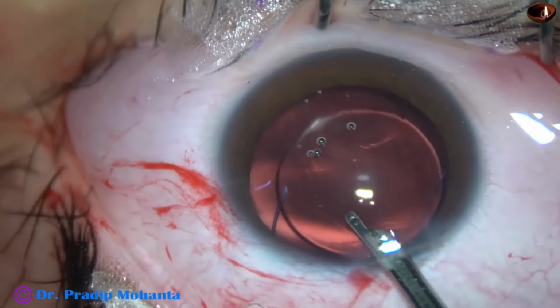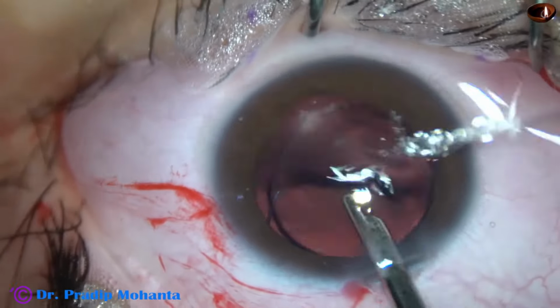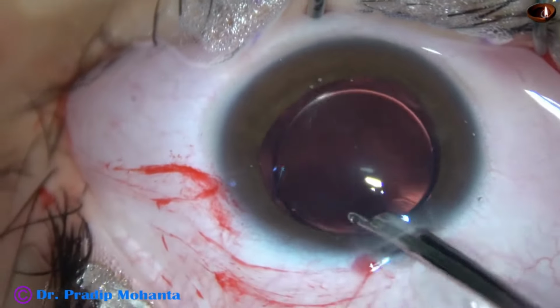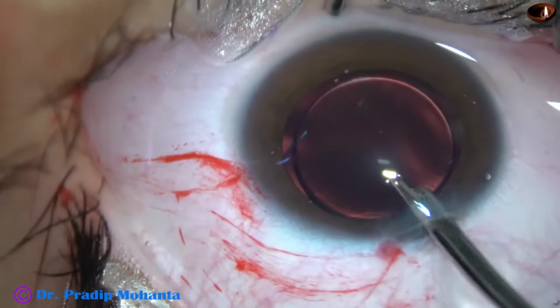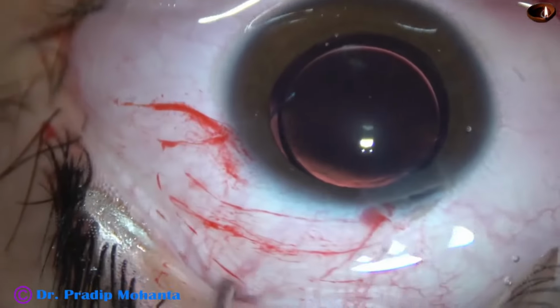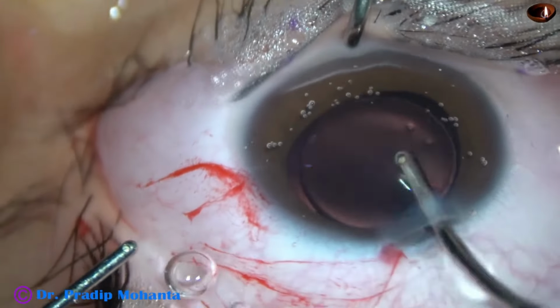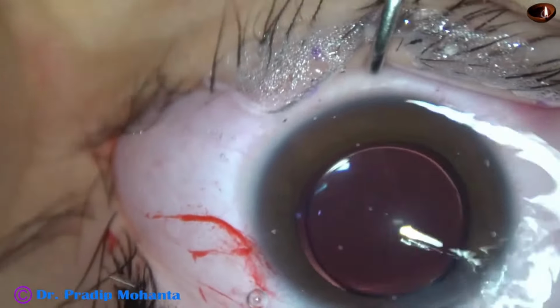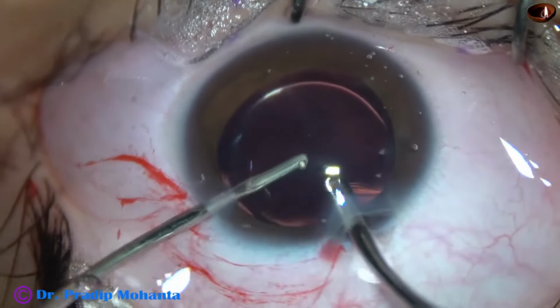In this case, we have explained to the patient that clear lens extraction and intraocular lens implantation will remove her accommodative power. She will not be able to accommodate. What we suggested is either phakic IOL, which she could not afford, and the complications of phakic IOL she didn't like. So we told her that we will keep this eye 1.5 diopter myopic, and she will be able to do most of the work without any specs. But for clear vision, for distance as well as for near, she will have to use spectacles, either bifocal or progressive multifocal. So she opted for progressive multifocal spectacles. After explaining all the pros and cons of phakic IOL, the patient chose this option, clear lens extraction and intraocular lens implantation.